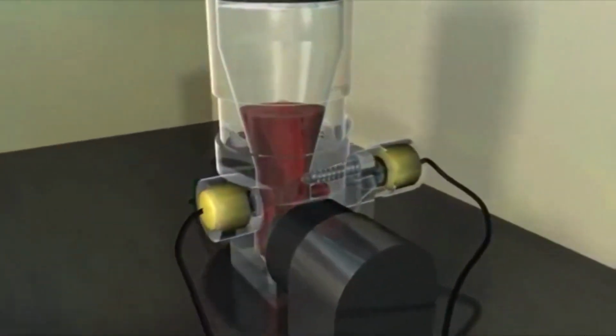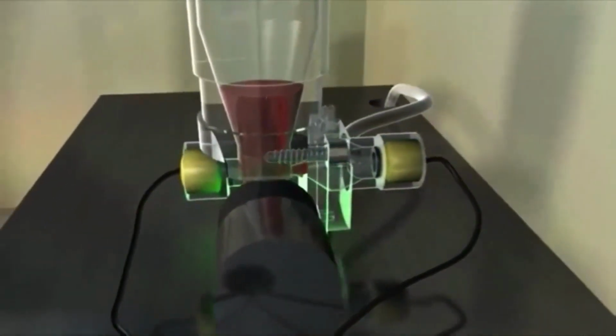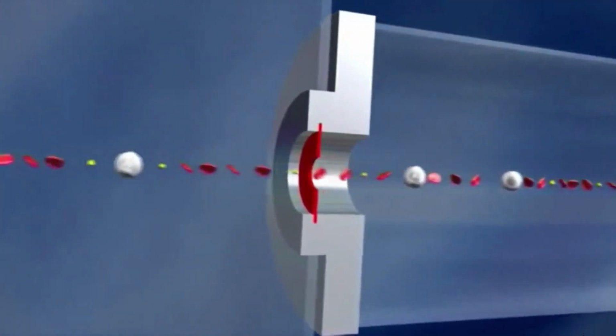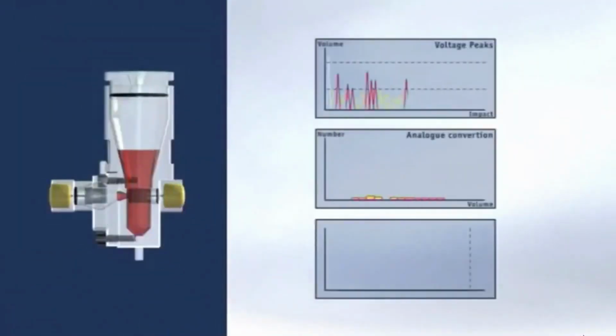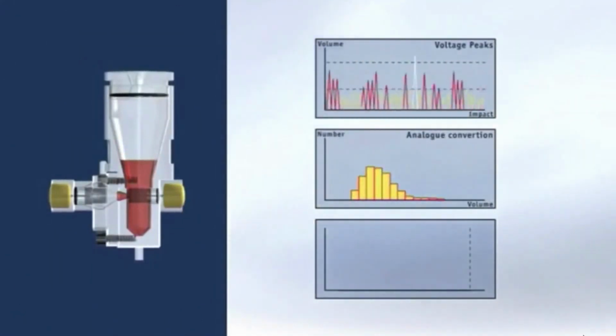Presently, over 98% of automated cell counters incorporate this technology, which is referred to as the Coulter principle. In the past 75 years, the technology has also been used to characterize thousands of different industrial particulate materials. In a Coulter counter instrument, a tube with a small aperture on the wall is immersed into a beaker that contains particles suspended in a low-concentration electrolyte.